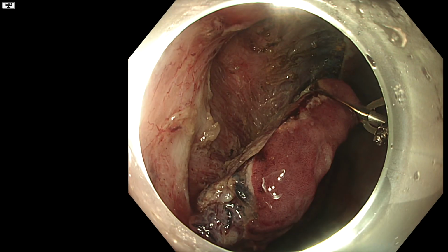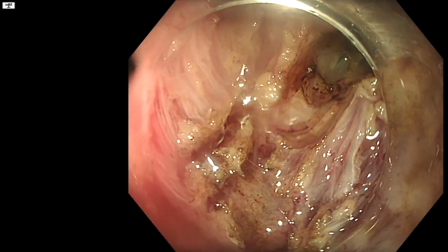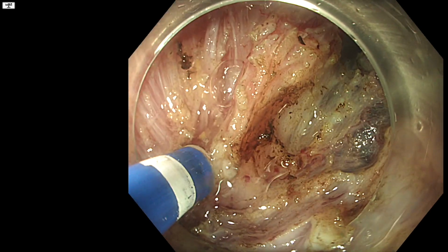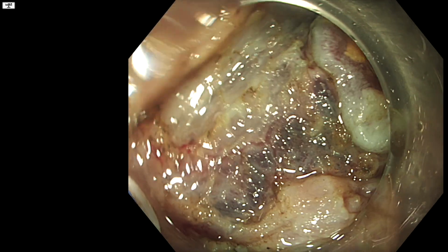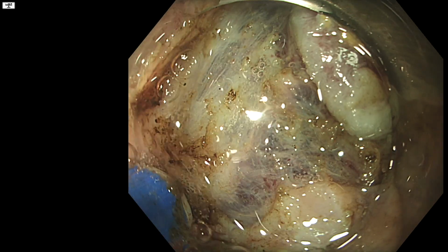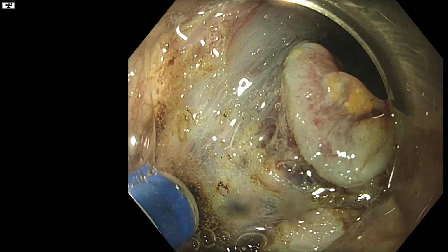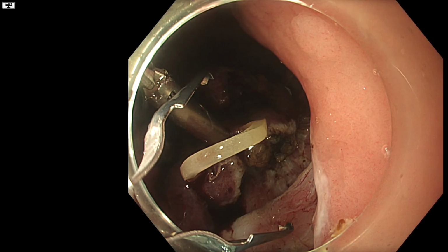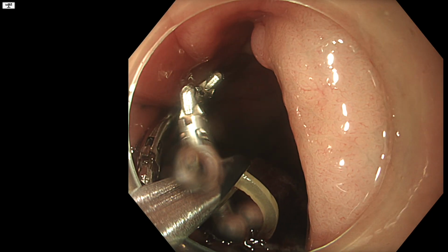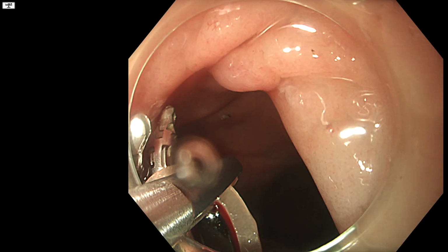As you can see, we now have a much better exposure of the planes beneath. There is some charring from using coagulation current whilst cutting through the muscle. That's expected, but on the side here we've got a bit of remaining submucosa we still have to dissect, so we can probably use this traction to complete this whole area here. And once that side of the lesion is done, we'll reposition another traction to expose the anal side of the lesion and continue with the dissection.